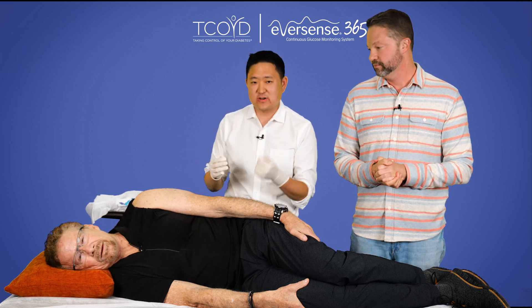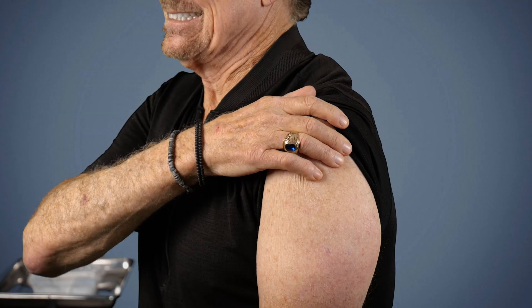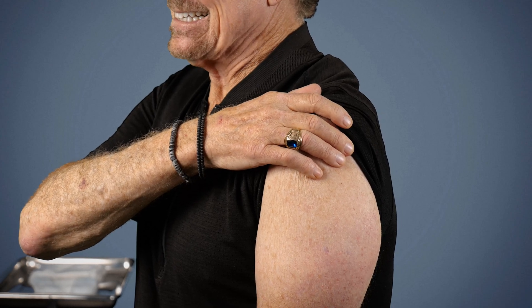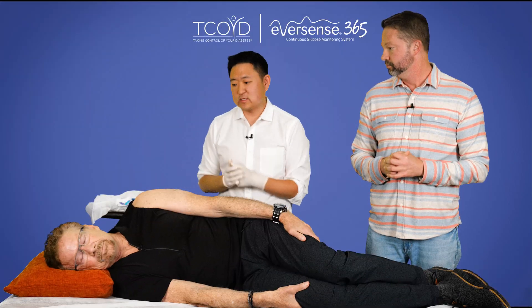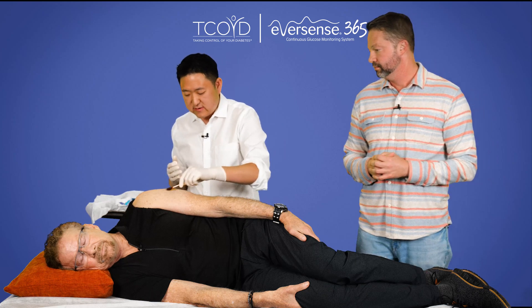All right, so we've already identified that Steve wants to do the procedure on his left arm. We've ensured he can reach it easily. I've examined his arm. And as you can see in this previous footage, the scarring from his previous two insertions are minimal and barely visible at all. I will be doing the entire procedure here today, but we may shorten it for time. All right, so we're going to get started. I'm going to use these betadine swabs right here to make the area semi-sterile.